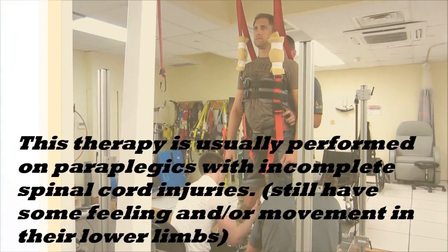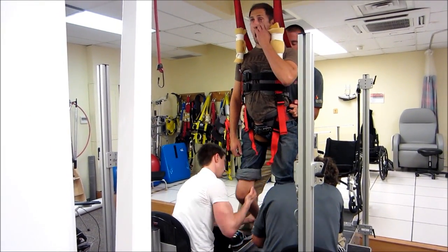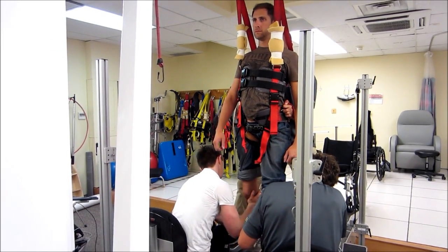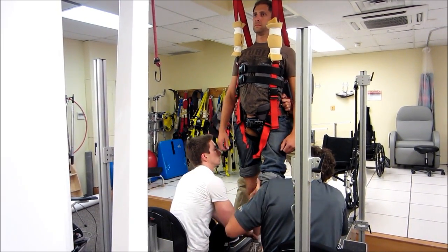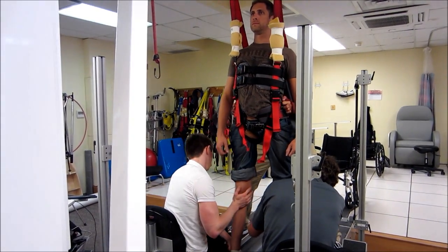So here, guys — Matt, again, you're on pretty strong pedal tilting towards you. And Brian, I'm just looking at your ability to keep your chest out and your shoulders back.